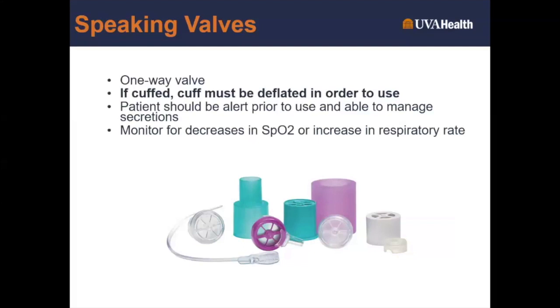Now, they also have caps which are used, which are not necessarily a speaking valve. It's literally a cap that you put over the trach itself. This is used when the patient is being kind of road tested to see if they can have their trach come out.